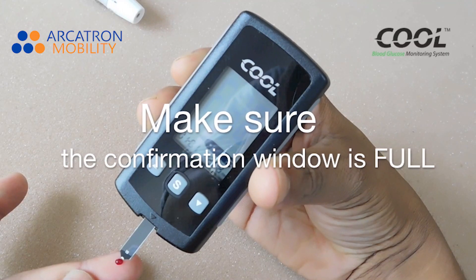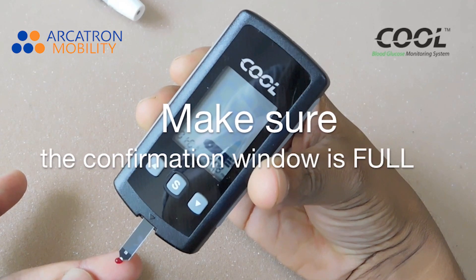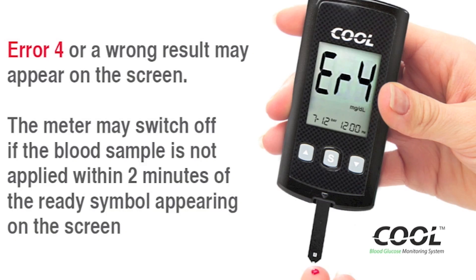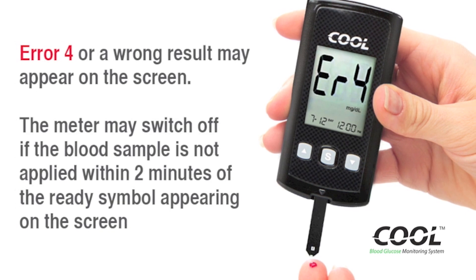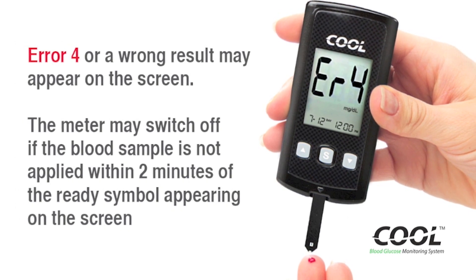Make sure the confirmation window is full. If the confirmation window is not filled before the meter starts counting down, error 4 or a wrong result may appear on the screen. The meter may switch off if the blood sample is not applied within 2 minutes of the ready symbol appearing on the screen.